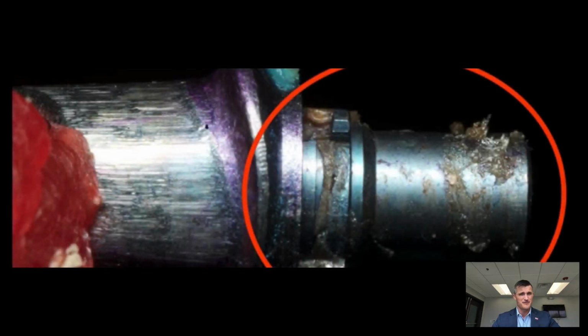They also took an internal flat-to-flat implant with platform matching and put it underneath a resin similar to soft tissue, like gum tissue. They put fluid on it, and they wanted to see whether this connection pulls fluid into the connection when subjected to a dynamic load. You can see that fluid squishing into the connection. This is why, when you remove an internal hex implant after about 5 years, you have that stench coming out of the patient's mouth after you remove that abutment, because fluids are being housed inside of that connection and bacteria are proliferating inside of that connection.